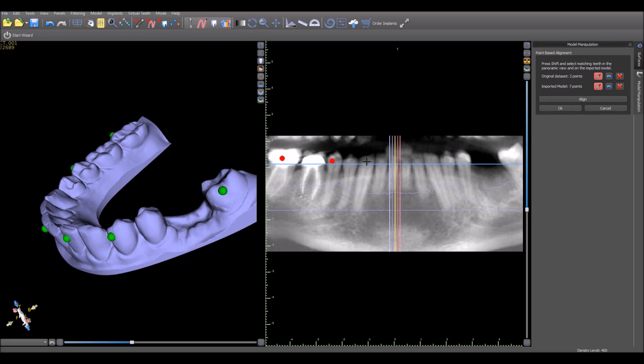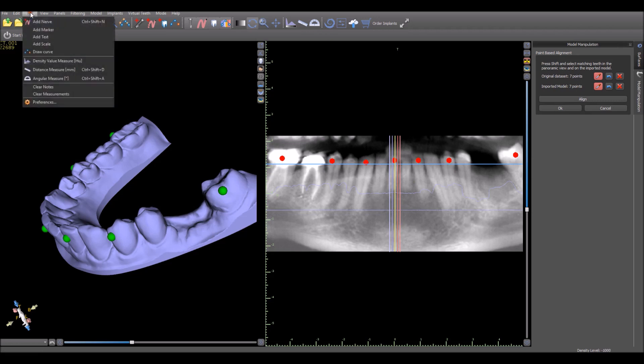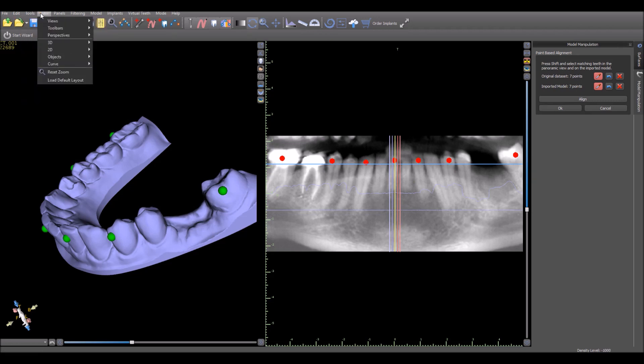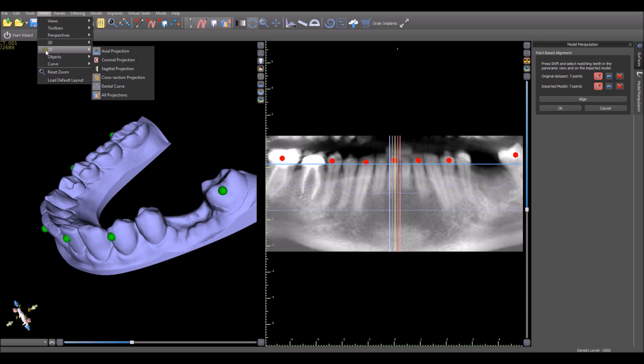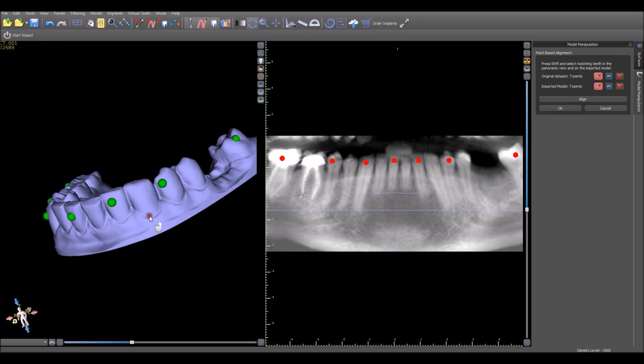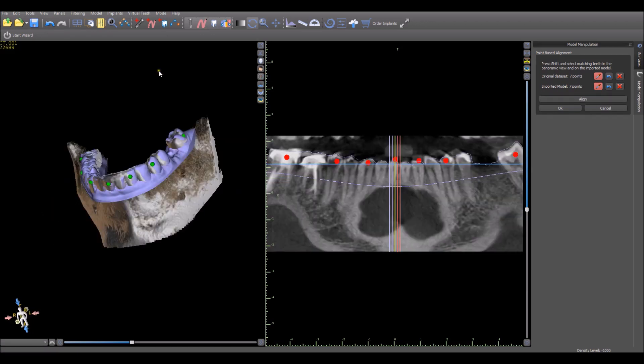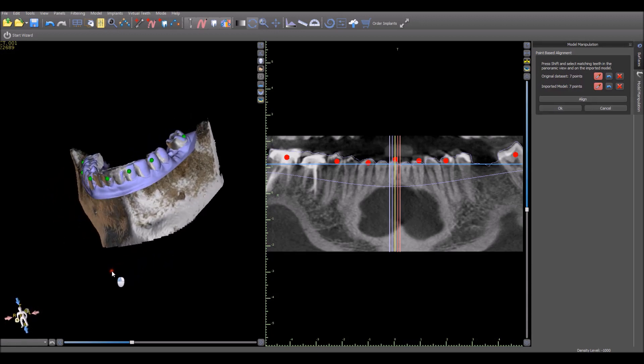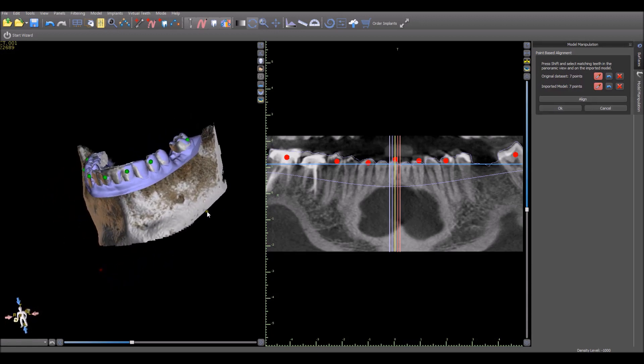Then I go ahead and once again hold down the Shift key and mark every other tooth on the CT scan. If you want to hide these multi-colored lines that represent the cross-sections, simply go to View 2D and remove all projections. That gives a bit of a cleaner look. Once you have your points marked, you go ahead and click Align. The software performs the alignment and the merge.